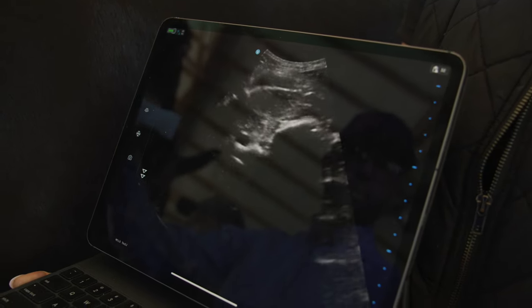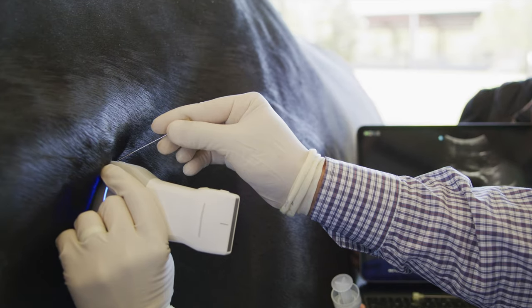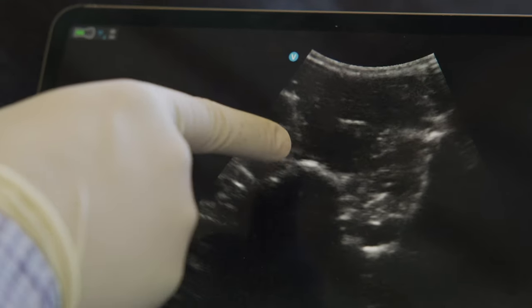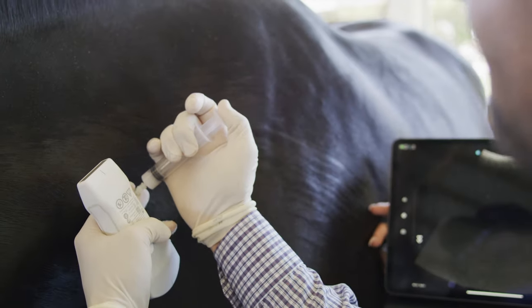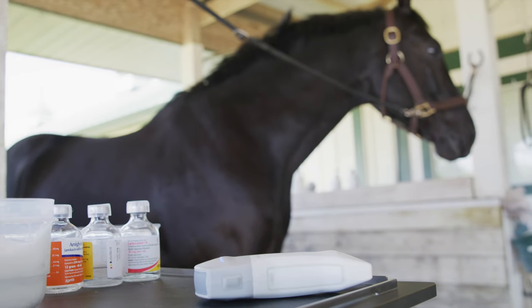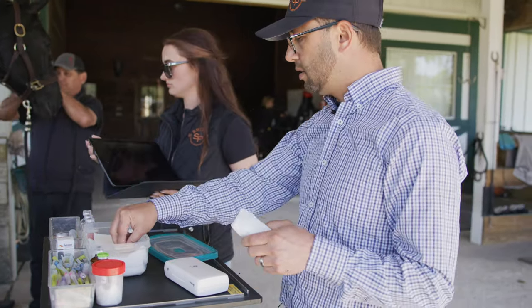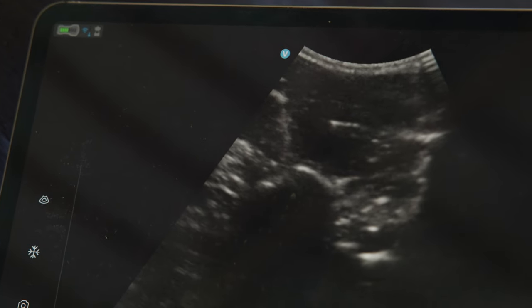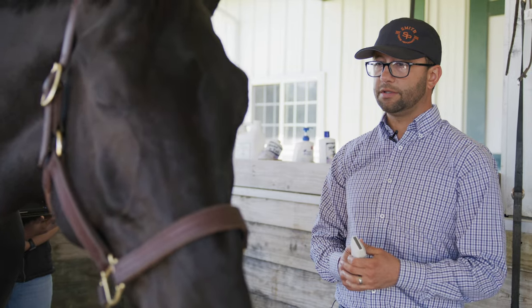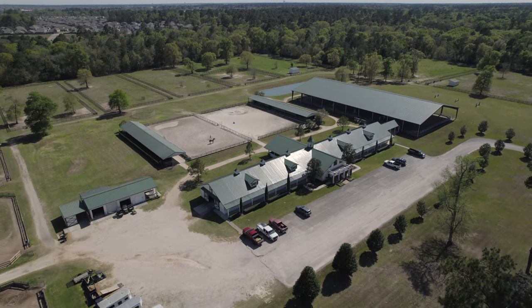Unfortunately I've found that out. I'm guiding it right into the facet now — I can feel it hit bone as it goes into the facet. Here's my needle coming into the image right now. I'm going to inject it with the anti-inflammatory and then we're done. There are no cords, so it's easy to stay clean, sterile, and in the correct area, improving accuracy with ultrasound-guided injection. This is primarily how I use this now — for cervical facet injections and also the SI, or sacroiliac joint injection — and I've found it very helpful in both areas.